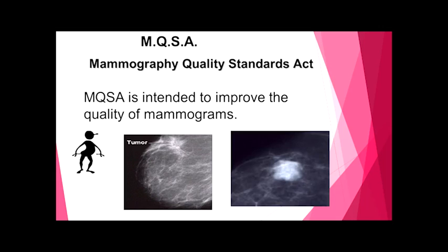Now, having said that, it hasn't always been an easy process, having been involved from the beginning of mammography. I trained in mammography and did mammography as a mammography technologist before there was dedicated equipment. Certainly before that we used compression consistently. And I know that the quality of procedure that I provided then compared to what we give our patients now is light years better than what it was. But it has been a bumpy road.